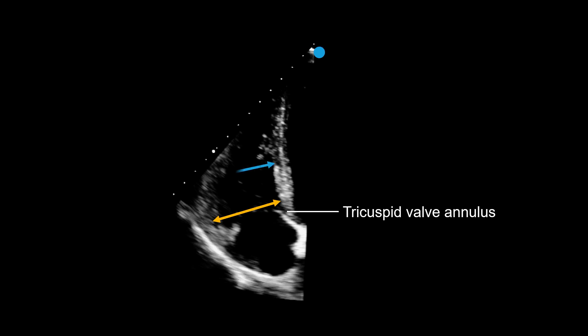Dimension two, the mid diameter, is taken across the middle of the chamber, just below the papillary muscles. Both of these measurements are taken from the interventricular septum to the right ventricular endocardium, on the left of the screen. Lastly, dimension three measures the length of the right ventricle, from the middle of the tricuspid annulus to the apex.